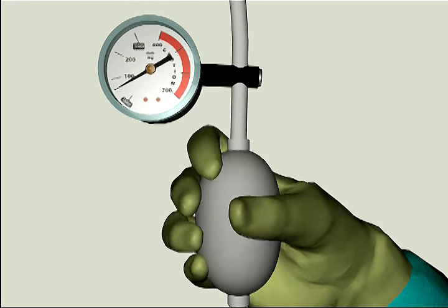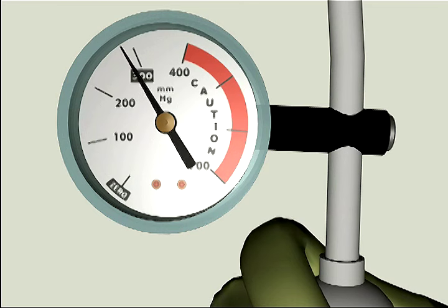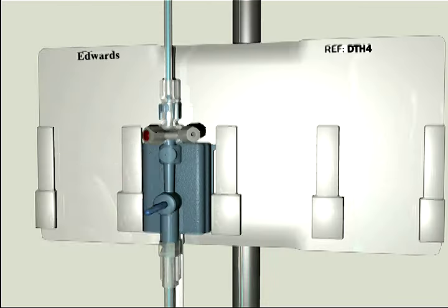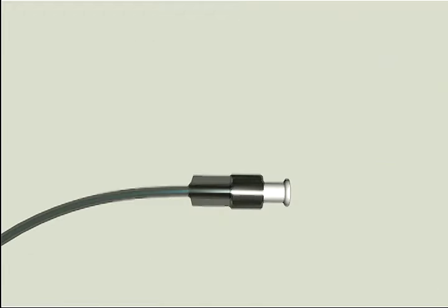Step 5: fast flush the TruWave transducer system. Pressurize the IV flush solution bag to 300 millimeters of mercury. Pull the snap tab to flush the system under pressure while tapping on the tubing and stopcocks to remove any residual bubbles.